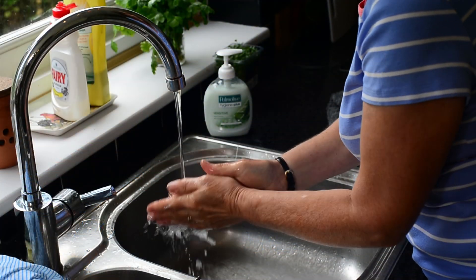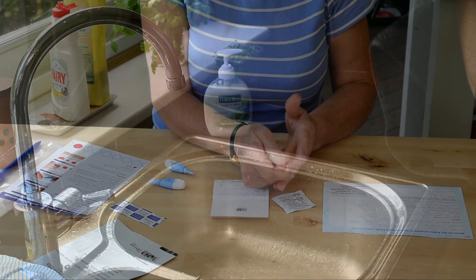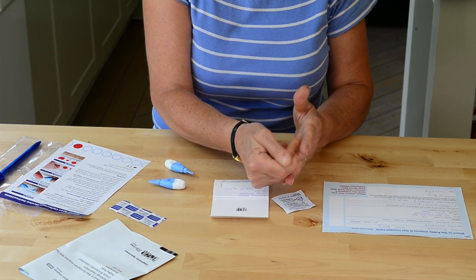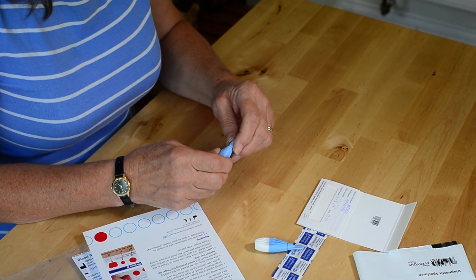Now we can get started. You must wash your hands with warm water and towel dry. Massage your chosen finger to be bled from the palm towards the tip and clean. Now you are ready to start collecting the blood spots.